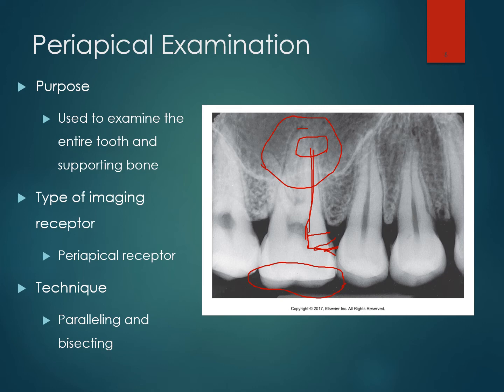And so infections always take the path of least resistance, just like water. And so the infection will burrow in to get to the nerve, and then it will travel up the nerve, because this bone up here is actually much softer and more porous than the tooth structure. So when it travels up here, it's able to eat away at the bone that's up here. And so you must have all of these factors when we look at periapical teeth radiographs.